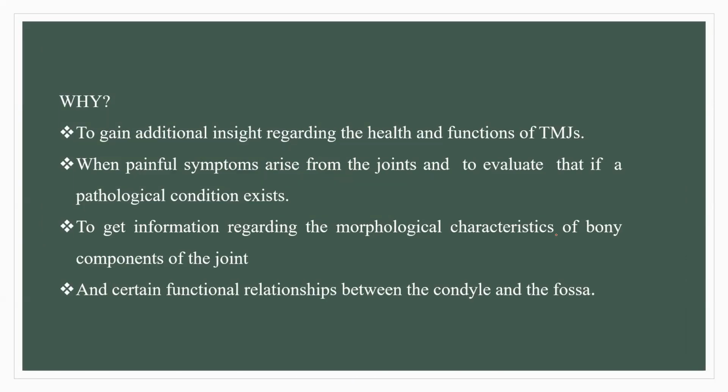So first thing is to gain additional insight regarding the health and functions of the TMJ. Once the patient is coming with some painful symptoms over the TM joint, so to get clarity of the diagnosis, we can take a TMJ imaging to get information regarding the morphological characteristics of the bony components of the TM joint.